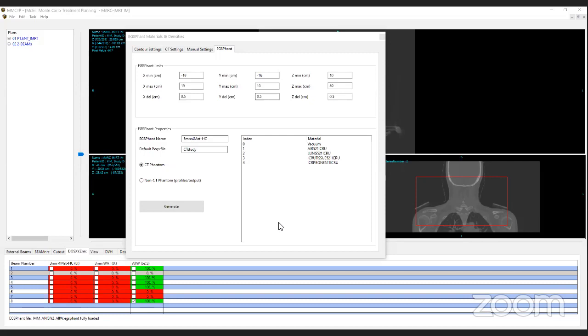Okay, usually, I think each planning system has its own way of storing the images, the dose, and the plan. They have their own formats in their database. But all of them agree that when you export, let's unify this into one single format, DICOM RT. If your software is very old, probably you will not find that option. But if it's not that old, you should be able to export the plan, CT, and contours with this.